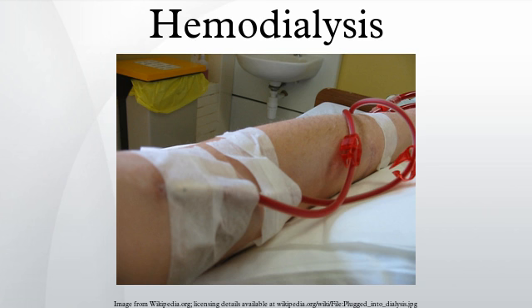Nocturnal hemodialysis. The procedure of nocturnal hemodialysis is similar to conventional hemodialysis, except it is performed 3 to 6 nights a week and between 6 and 10 hours per session while the patient sleeps. Advantages and disadvantages. Advantages: low mortality rate, better control of blood pressure and abdominal cramps, less diet restriction, better solute clearance effect for the daily hemodialysis, better tolerance and fewer complications with more frequent dialysis.